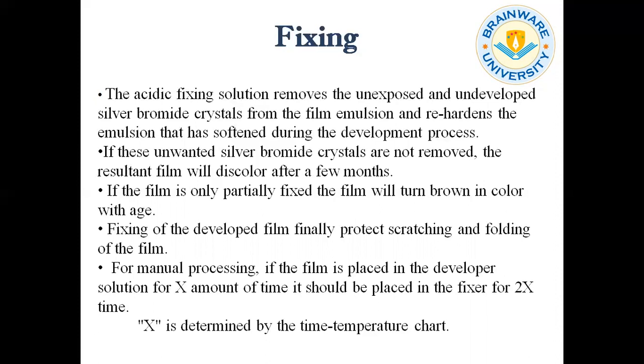So, for example, of development, fixing time and temperature, here you can see if we take x as the time and temperature of the developer solution, the time for the fixer should be 2x, and the time of wash of the film should be 3x.